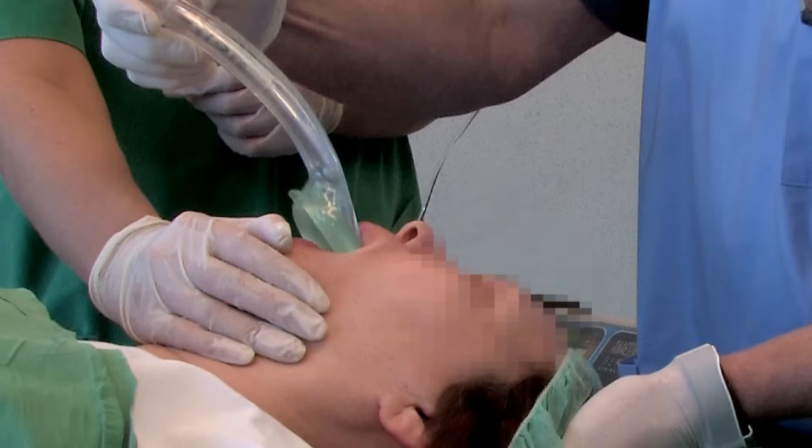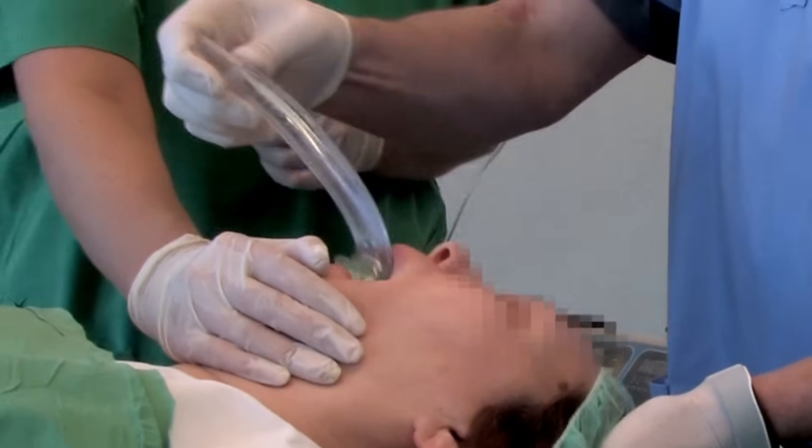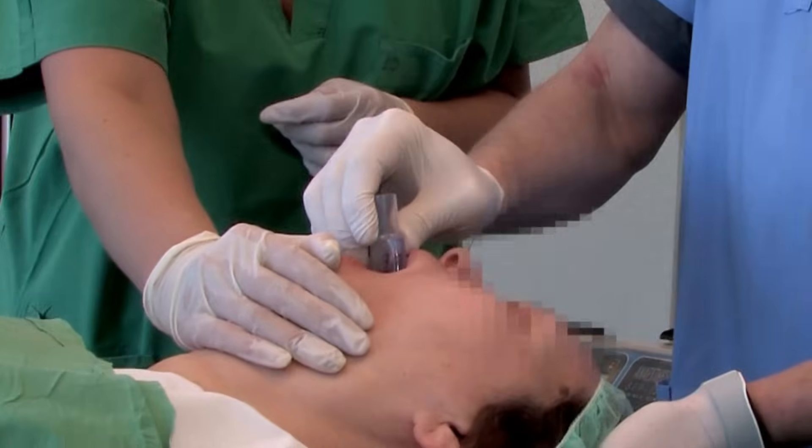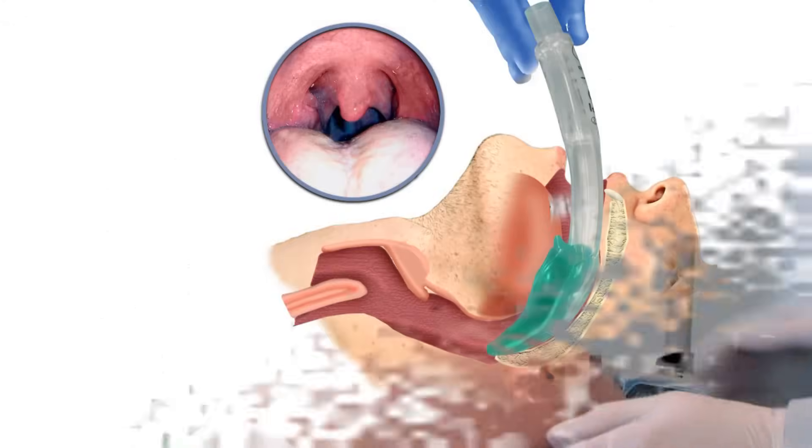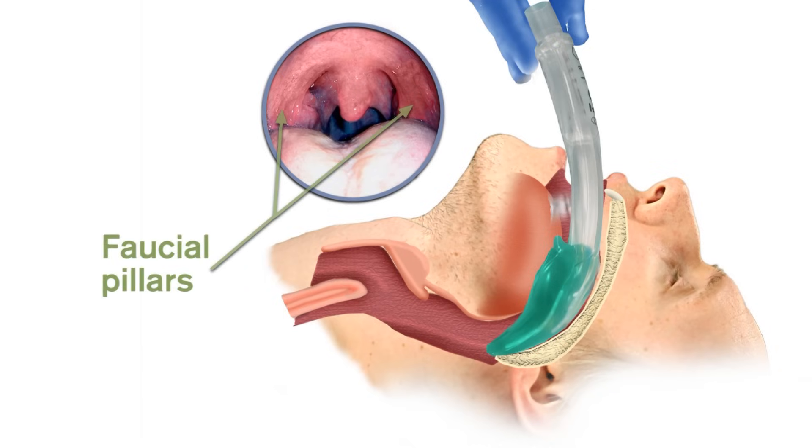When inserting the iGel, it should be remembered that partial resistance and then a feeling of give way may sometimes be felt before the end point resistance is met. This is due to the passage of the bowl of the iGel through the faucial pillars. This is quite normal and consistent with correct insertion, but in such cases insertion needs to continue until definitive resistance is felt.